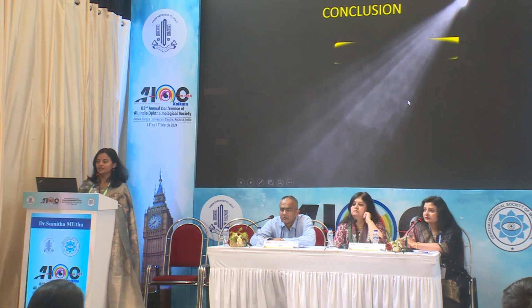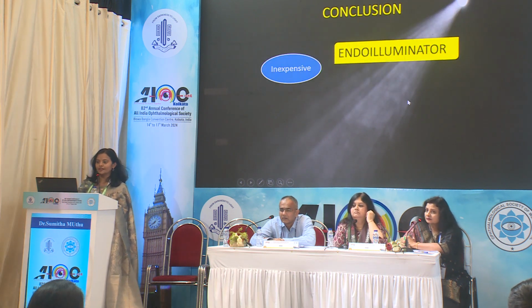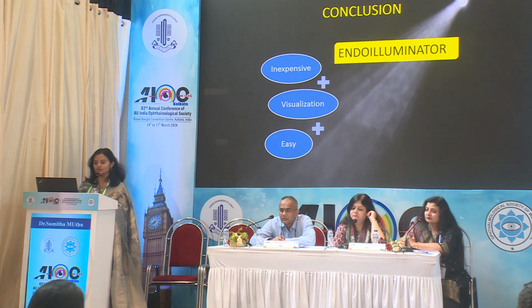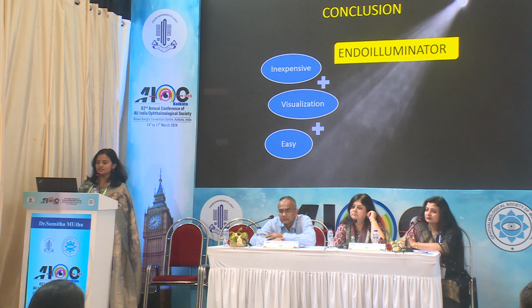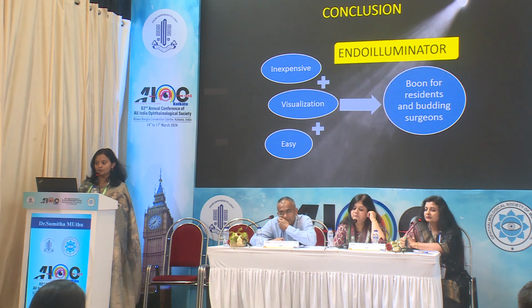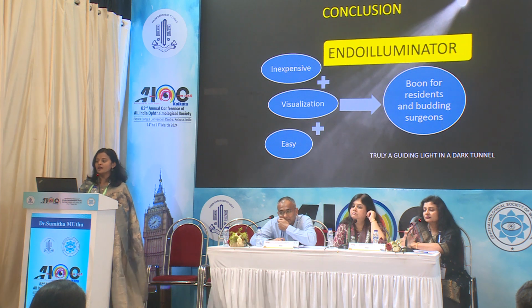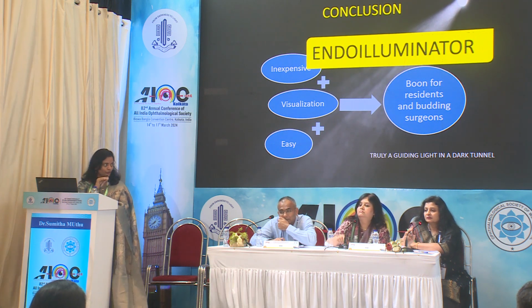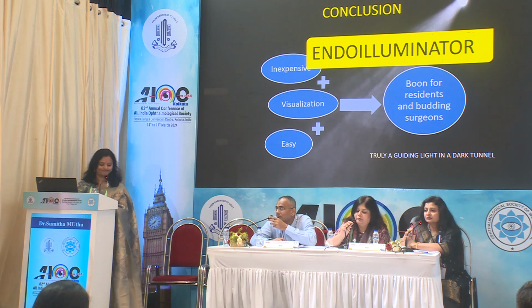Endo illuminator therefore is an inexpensive tool which helps in proper visualization of the structure and makes each of these difficult steps a little easier for a novice surgeon. So it is a boon for residents and budding surgeons, and acts as a guiding light in a dark tunnel. Thank you.